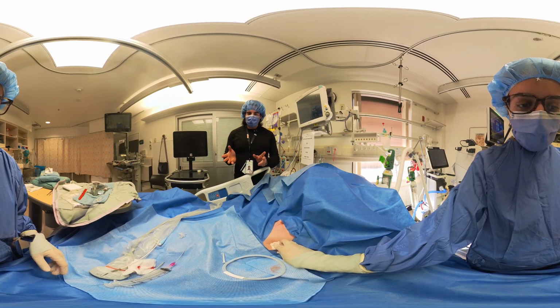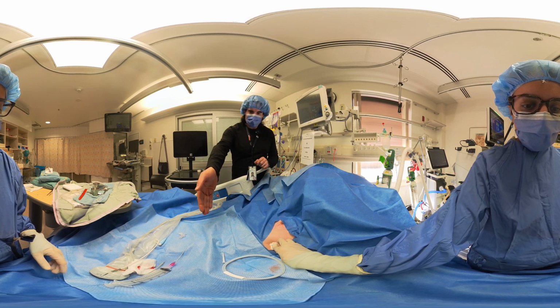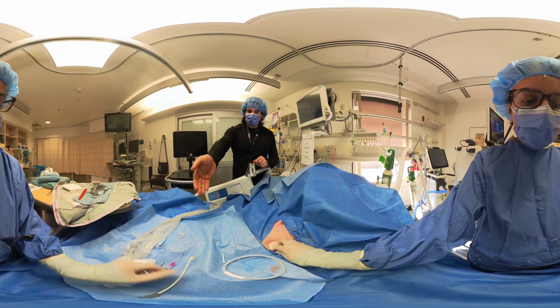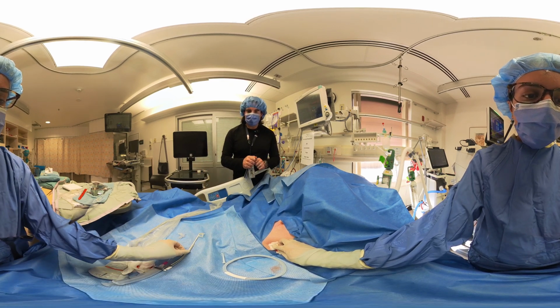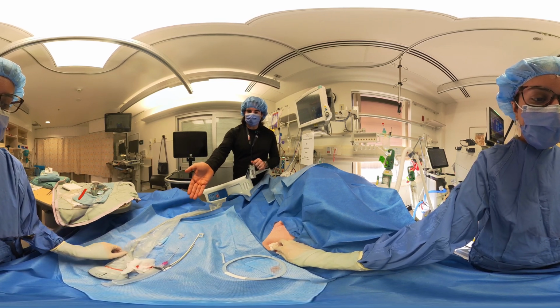So we have our kit here. We have our finder needle. Okay, that's with the pink hub. Okay, we have our wire, which we can see here, a J-hook wire. Then in the gray there, we have our dilator. Okay, that's our dilator. Then we have our pigtail, which has no string on it and unfurls over the rear end of the wire. And then we have our device, which is luer locked to Christmas tree, which attaches to a chest tube assembly.